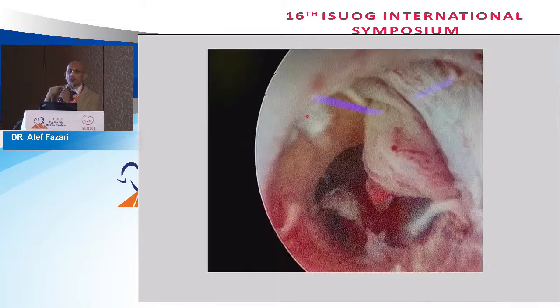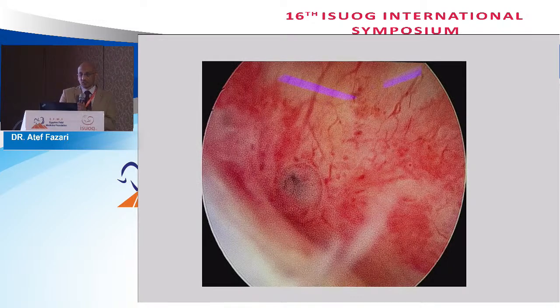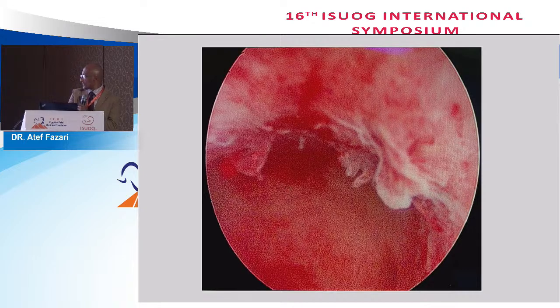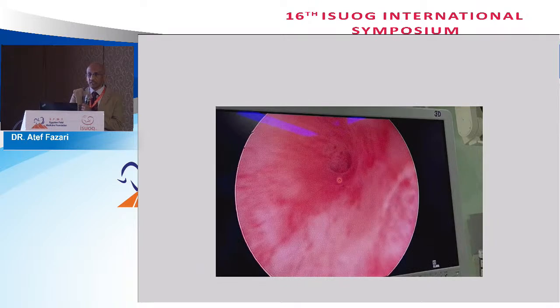We opted for hysteroscopic resection. So hysteroscope, sorry for this artifact. This is the mass, and this is the endometrial cavity. I went by the hysteroscope to see the posterior side. This is the left side of the model. This is the right side of the endometrial cavity, very clean, and we did resection. This is the examination after refining, this is the final look. This is normal. And we recheck again for some reason, maybe some residual. See, almost the same finding, and this is one of the cases that can be managed by hysteroscope.